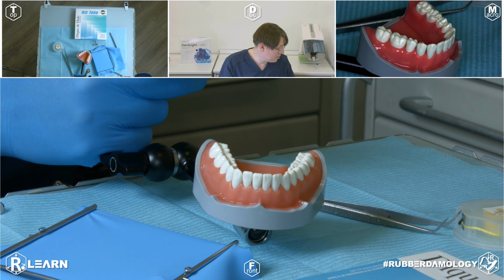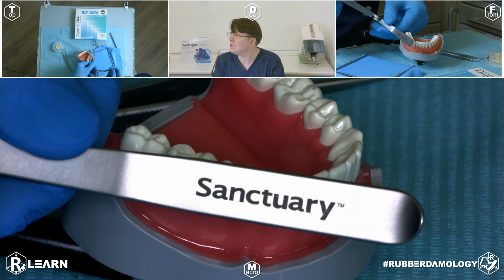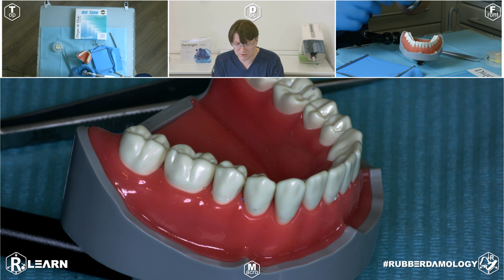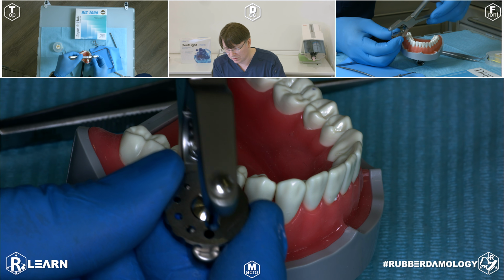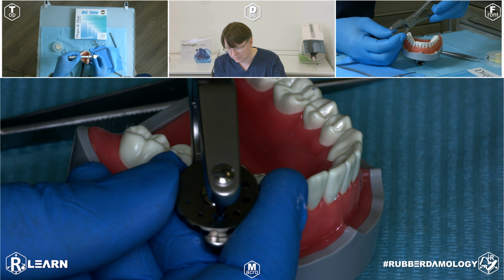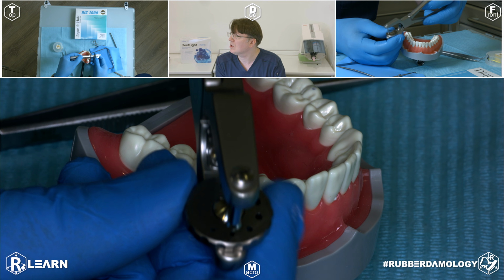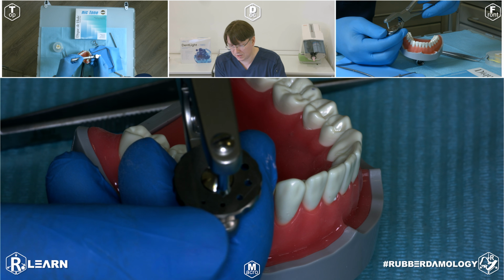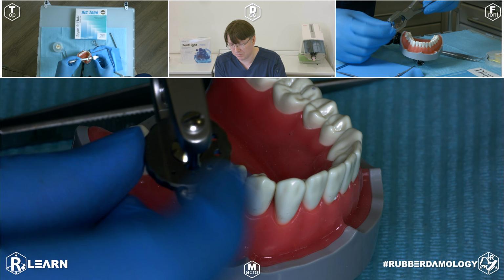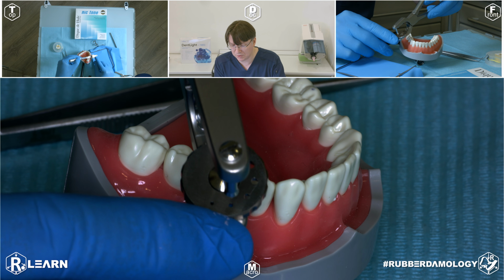Then let's discuss properties of the punch. I work with the Sanctuary dental punch. Very interesting with the markup of diameters of perforations. A big hole: molars, premolars, canines, upper incisors and canines. Lower incisors, and if you need more retraction of your rubber dam around the crown of your tooth, you can make the smallest one. For thin rubber dam plates, you can make a smaller hole and receive much higher retraction of soft tissues.